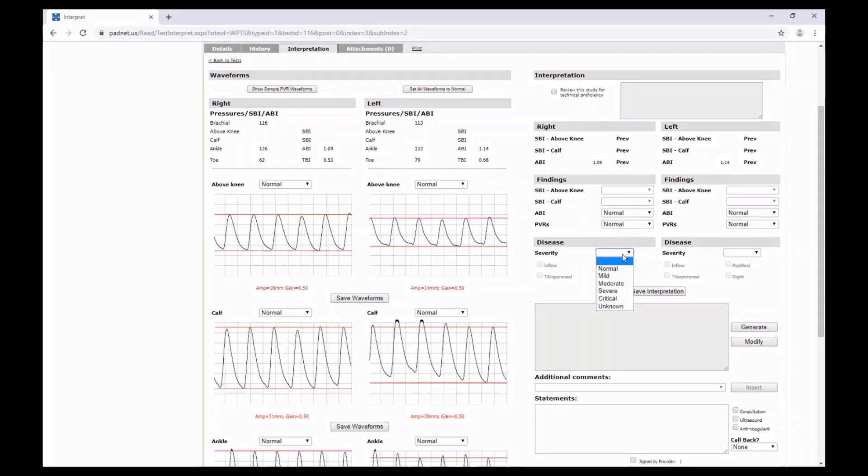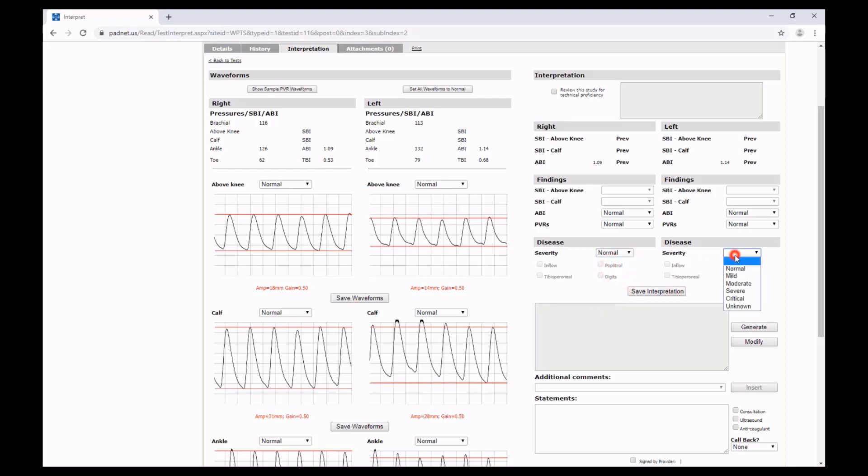From here, we can designate what the severity of the disease is. In this patient, we have normal ABIs and relatively normal PVRs. So it's fair for us to say the severity of the disease is normal on both sides.